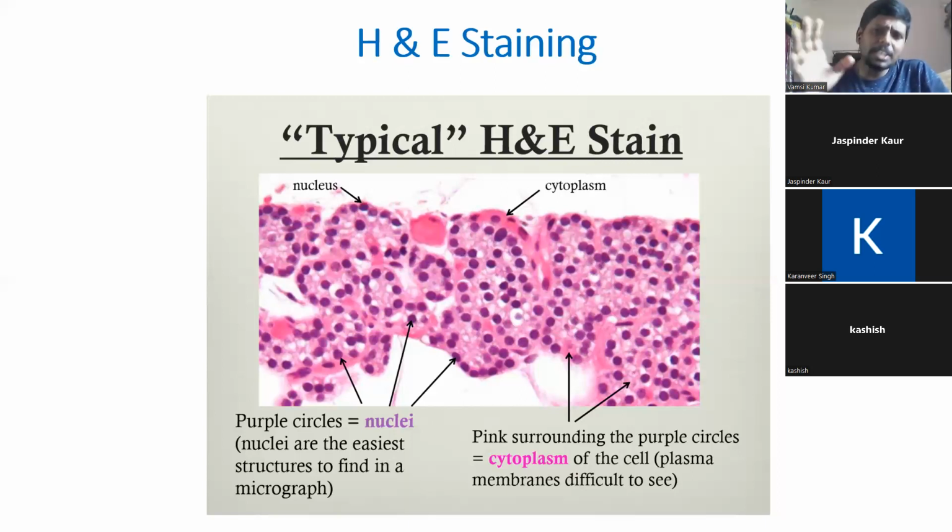Even the heart is very resistant to cancer, but still all types of cancers can be easily identified with the help of immunohistochemistry. Sometimes there will be fat deposits, sometimes even enzymatic deposits in the tissues. Even those enzymatic deposits can be tracked with the help of immunohistochemistry. And that is how immunohistochemistry is different from classical histopathology.